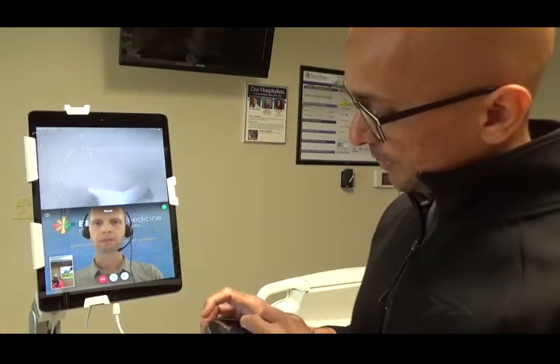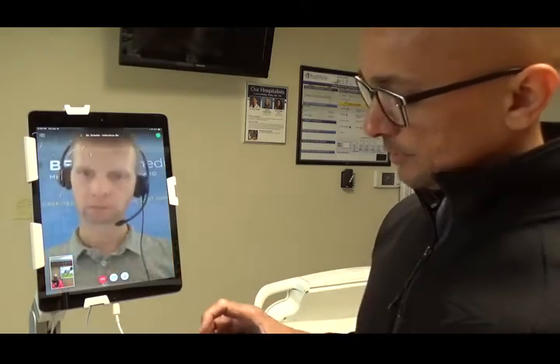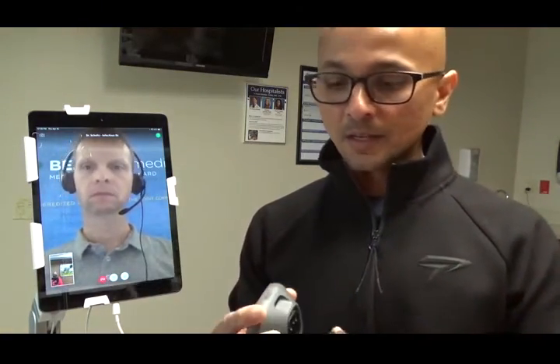And we could shut off the camera here on the device. But you could put the tongue depressor attachment, and then there's a tongue depressor separate thing that you put on because that has to be washable. Once again, I don't expect you guys to use it. This is more for pediatrics, really. And sometimes for pulmonary, for the airway side of things. But that really is it for physical exam.